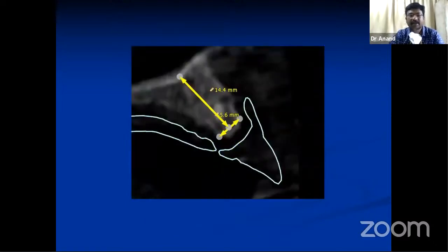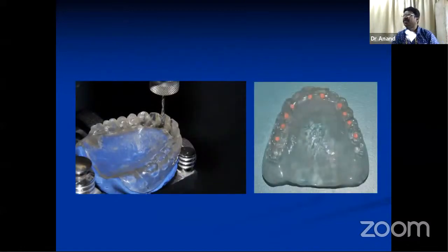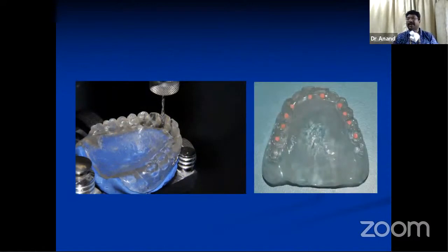So here I have measured it, taken the implant from the implant library and placed the implant. In case you don't have this kind of software, what can we do? Here we can do another technique where you place gutta percha, because the denture is not going to be clearly visible unless you have a third-party application where you match the isodensity of the denture. In the earlier slices, I told you the denture is visible, but normally a denture would not be visible unless you have third-party software with an isodensity which can be easily picked up.